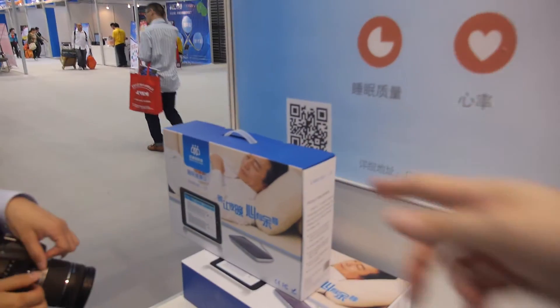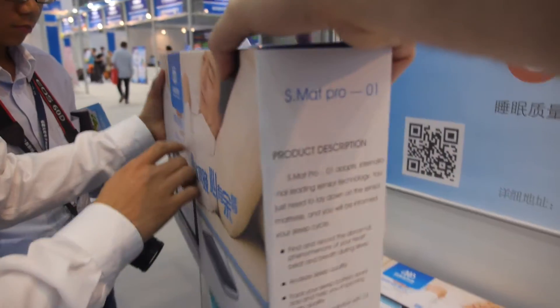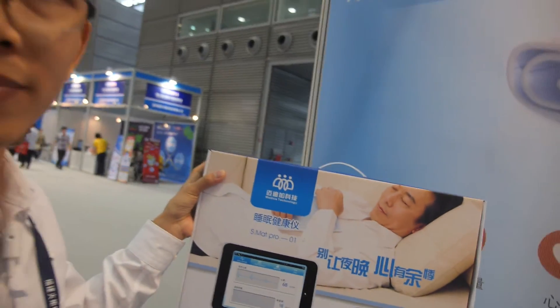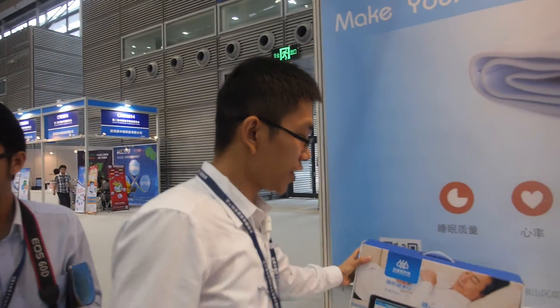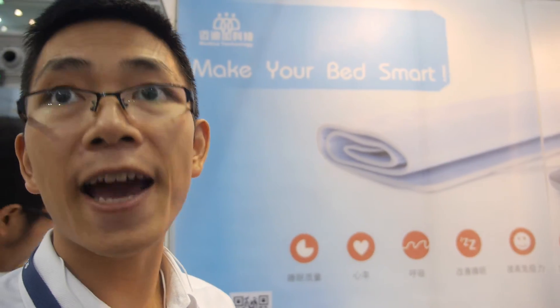The product name is SMAT Pro 01 by Medica Technology. Medica Technology is a leader in sleep quality monitoring — we specialize in sleep monitors and we are the first company in the world to develop this kind of product. No Japanese company, no American company, not even Apple does this.